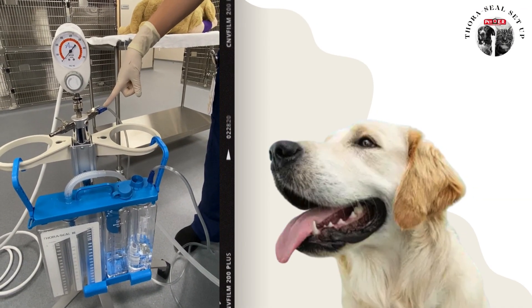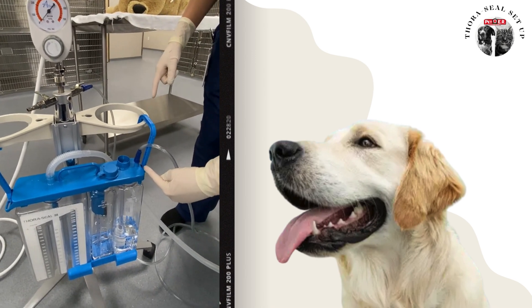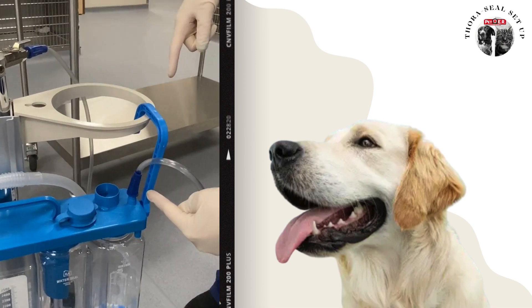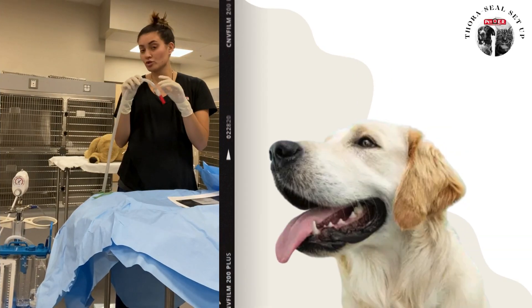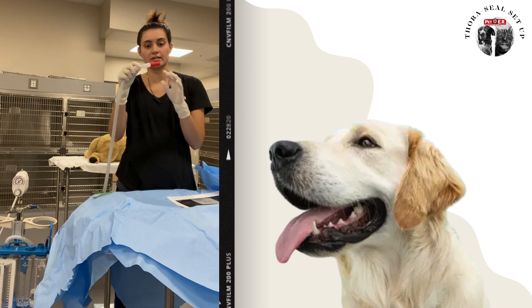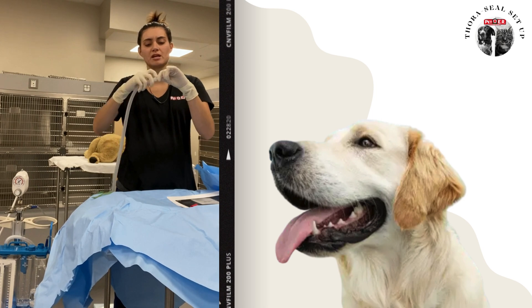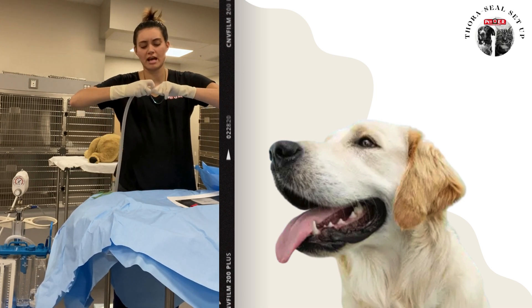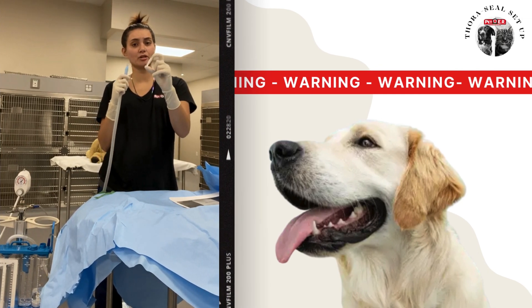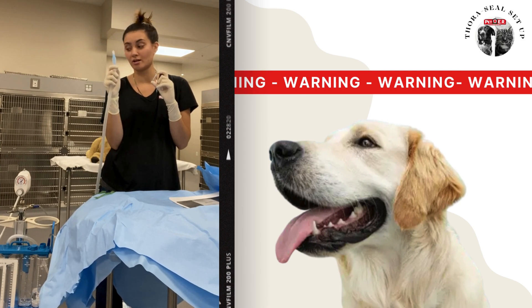The tubing that comes already pre-attached to your Thoraseal is going to look like this with a little red end. Take the red end off, and then take the pre-made Christmas tree out of it. Just making a note: we recently got these clear Christmas trees in stock — they do not fit hooked up to the tubing that comes with the Thoraseal. It has to be the old glue kind.